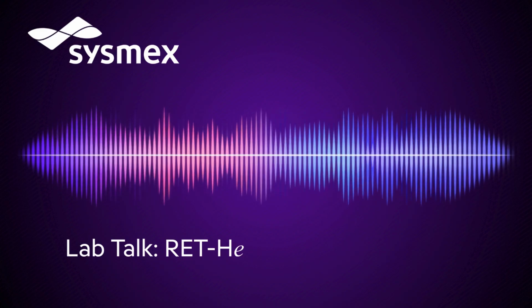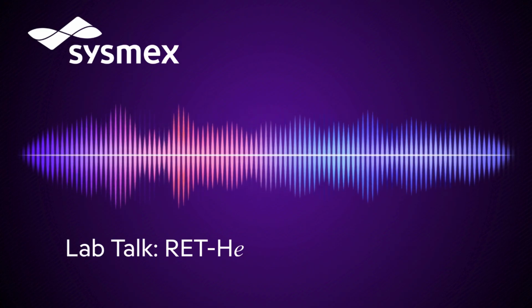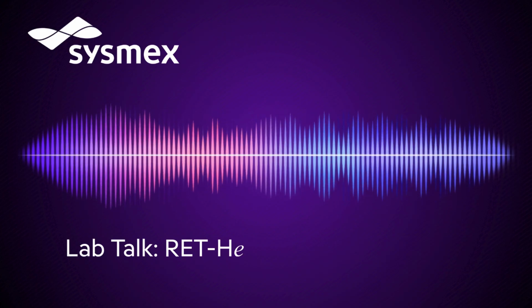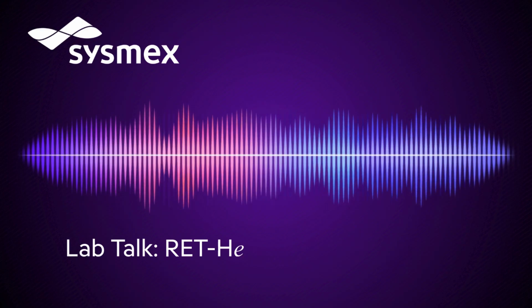Last but not least, RET-He may provide useful information to clinicians managing patients with challenging hematological conditions. So, the next time you see a RET-He result, you'll have a better understanding of what it's telling you about your patient's iron status.